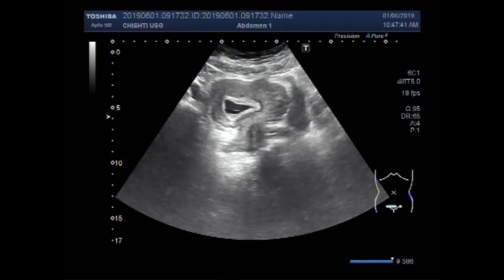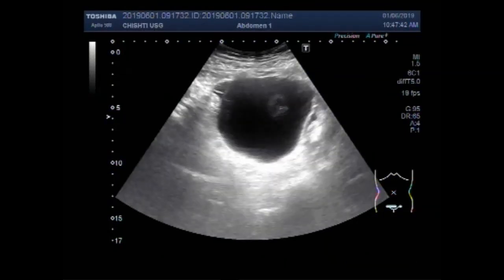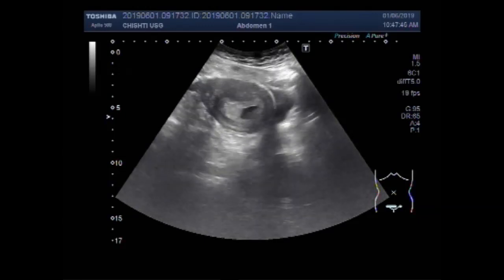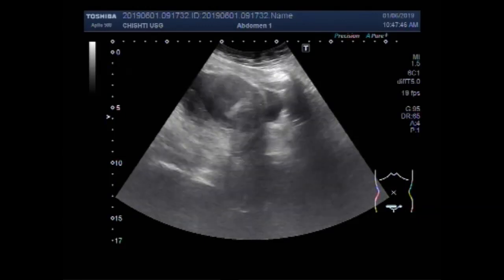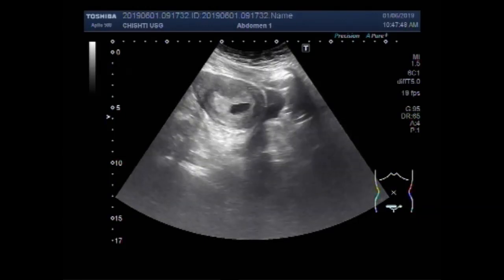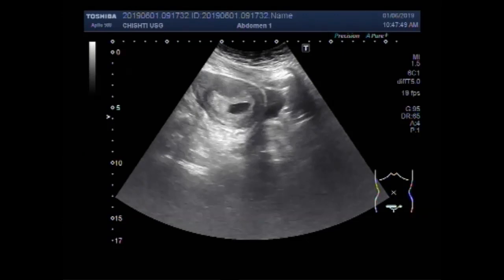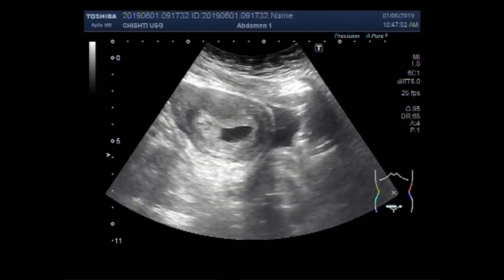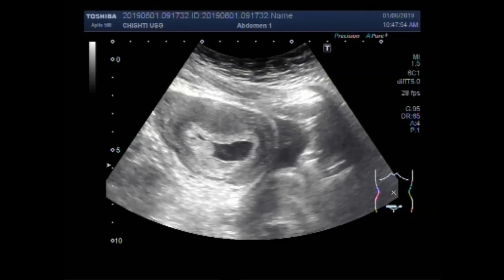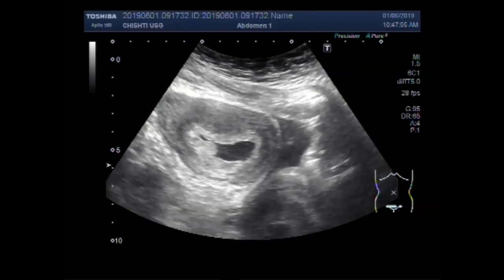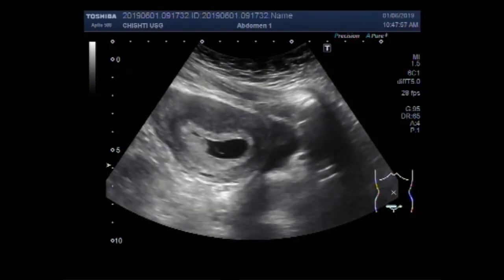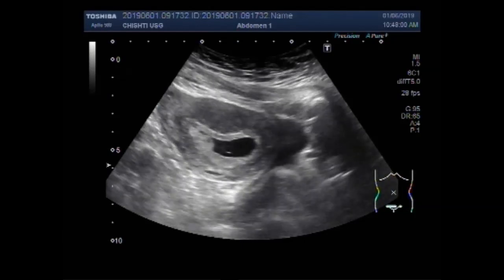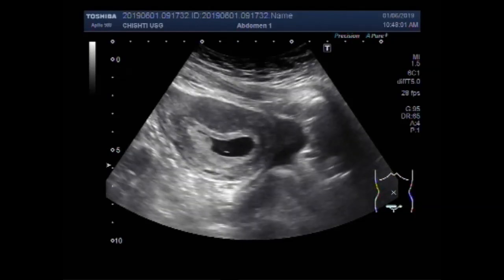Dear viewers, I hope you are all fine. This ultrasound video shows a gestation sac inside the uterus, a case of early pregnancy with blighted ovum, with an anembryonic pregnancy.